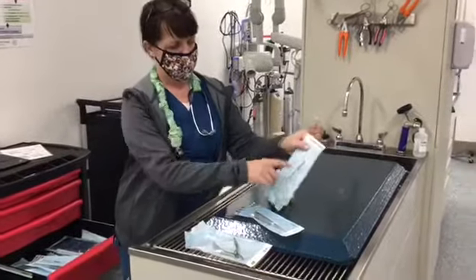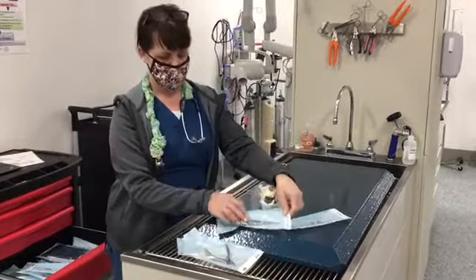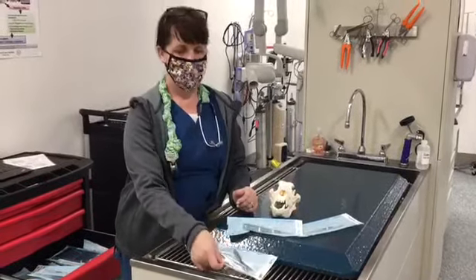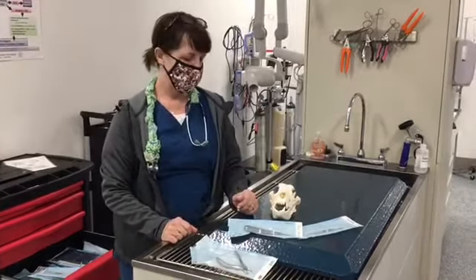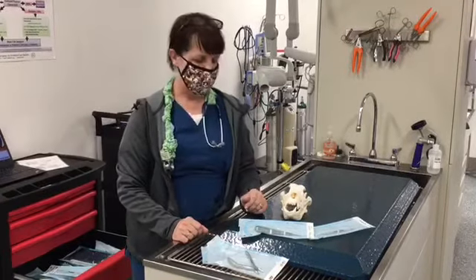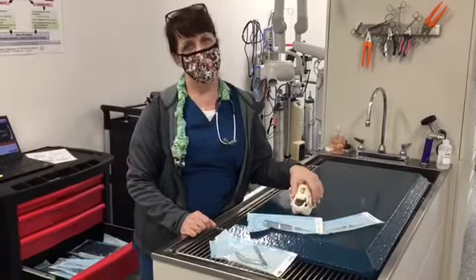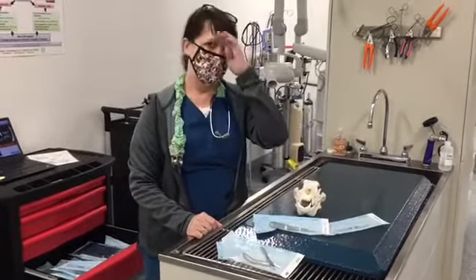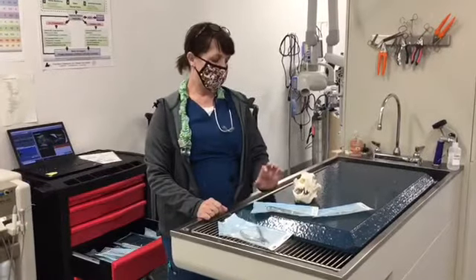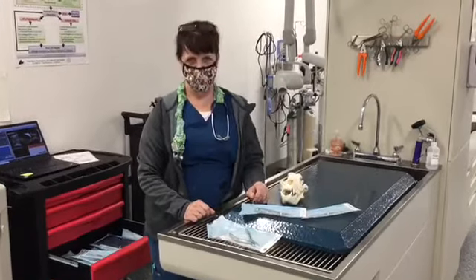And then we use those tools here, checking under the gums, and this one helps me pull teeth, and this one does too. So we use these when the doctor thinks that the tooth is very loose or has been diseased and we need to pull that out. And then the animal feels a lot better when they wake up. Their mouth isn't hurting anymore. So that's how we take care of that in our dogs and cats. And so they wake up and they have a nice smile when we are all finished doing a dental.